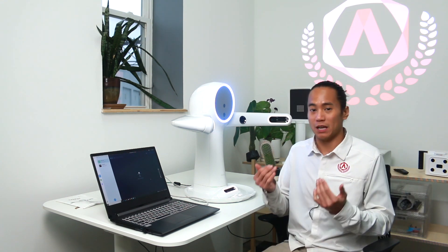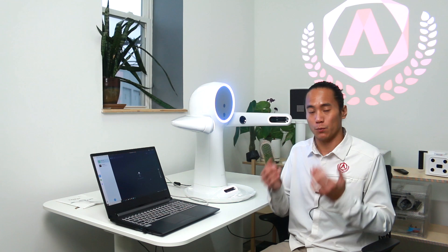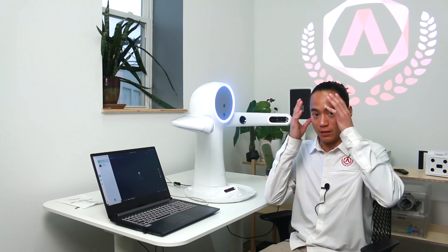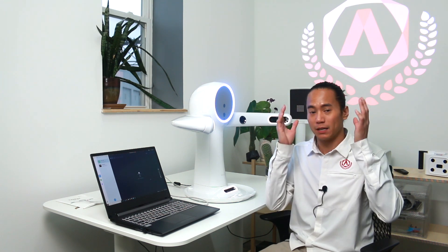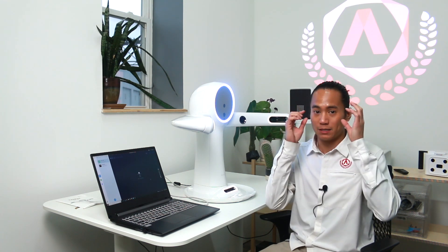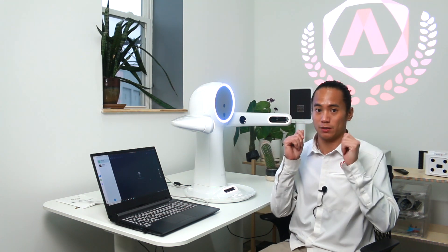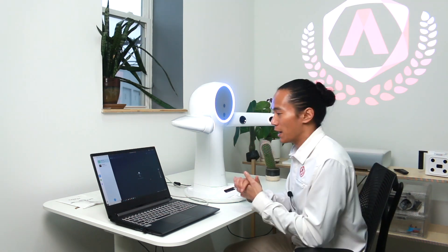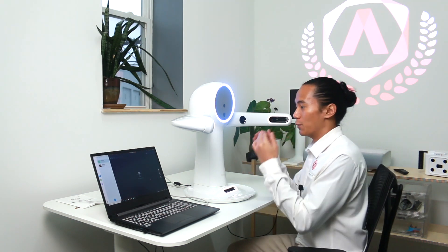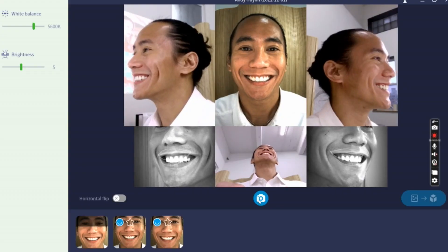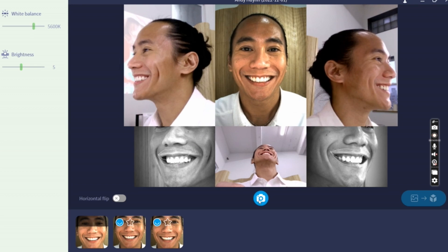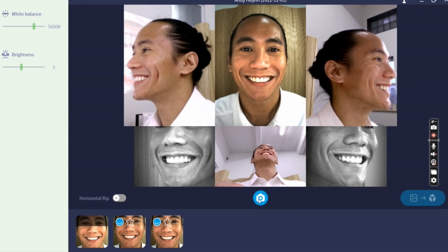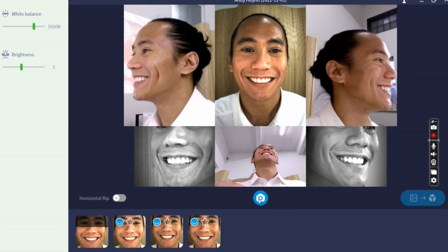If the patient has long hair, we want to make sure that everything is tied back — ideally also no glasses or earrings to get in the way of the scanner. From there, we want to ensure that when the patient aligns up, they stare straight into the scanner and their smile aligns up to the two guided areas on the screen.